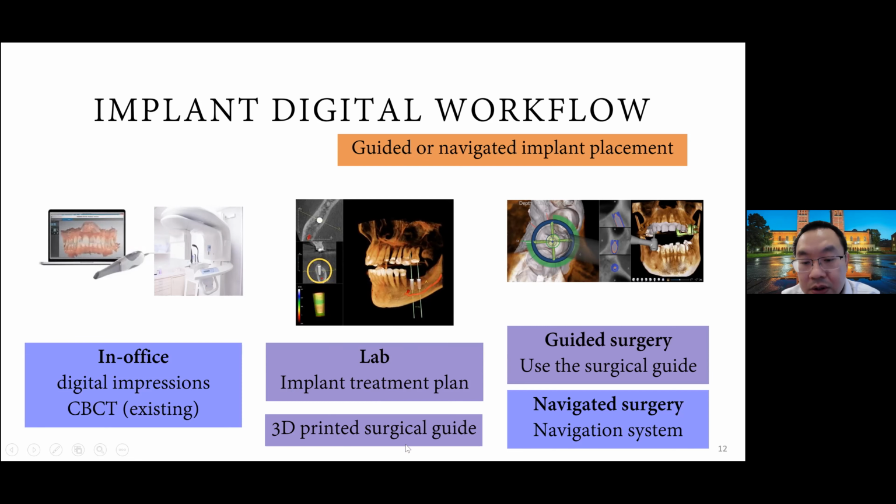And in that case, if you're doing a guided system, you can 3D print out a digital surgical guide, versus the traditional workflow where you take impressions and send it to the lab to fabricate the surgical guide. Now you can just print out the surgical guide, which is a lot cheaper in terms of material costs and time-wise too, okay?